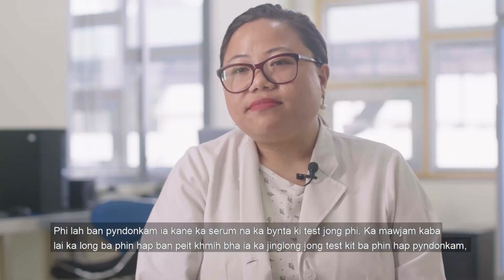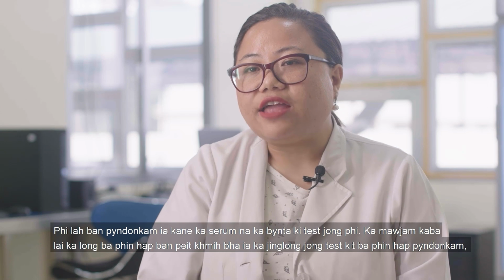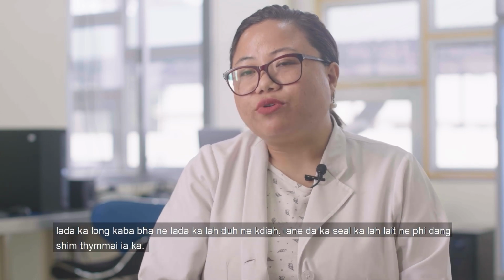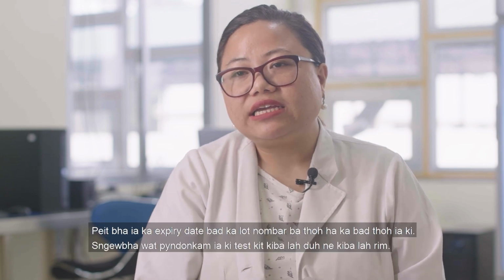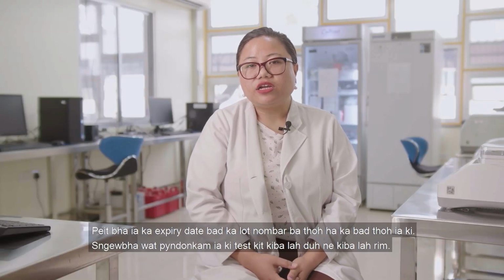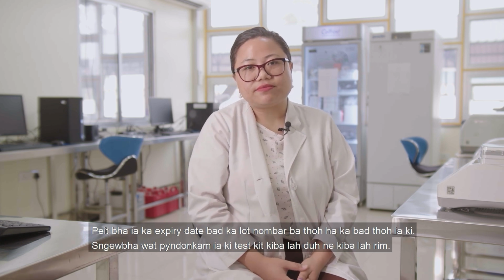The third step is you look at the test kit box that you're going to use, and you look at the integrity of that box, whether it's broken or the seal is broken if you have taken it out newly. You're going to look at the expiry date and the lot number. Note it down. Please do not use any expired kits.